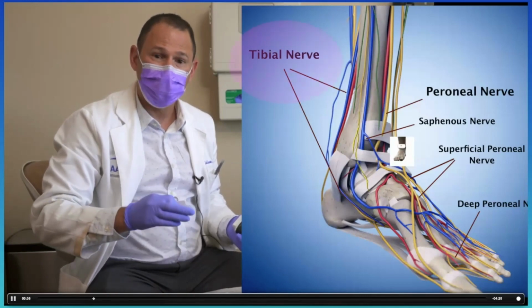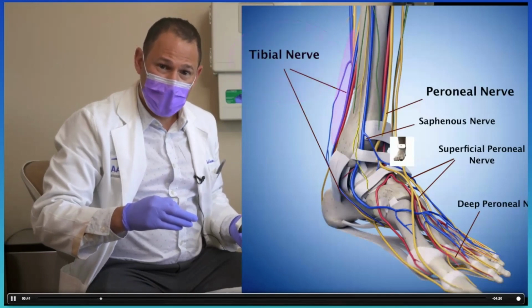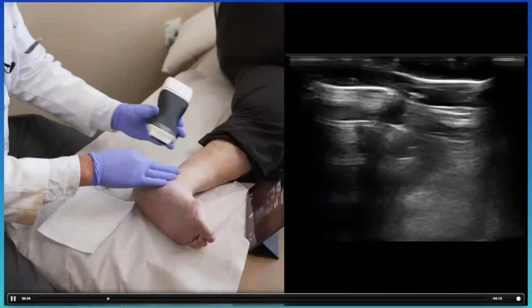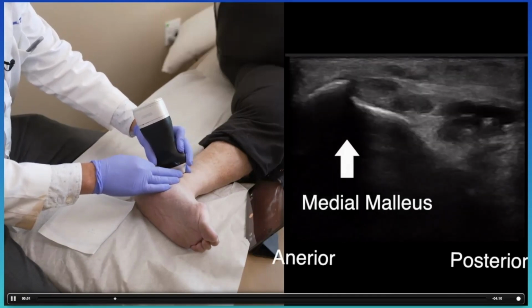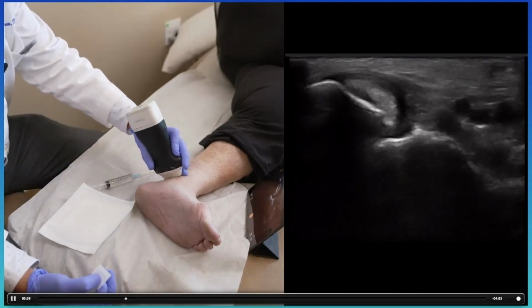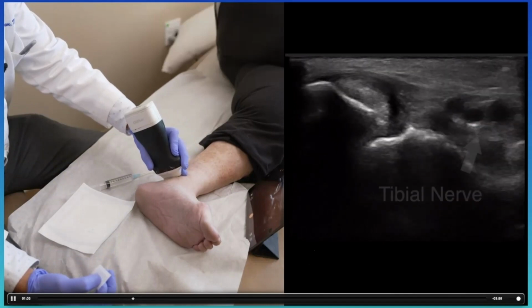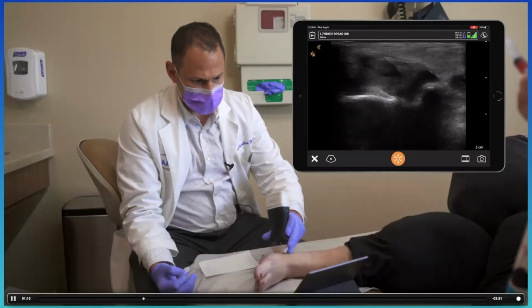So I'm going to go proximal to the tibial nerve, which innervates the medial and inferior aspect of the foot, and will hopefully give her enough anesthesia for the procedure. So to find the tibial nerve, I'm locating the medial malleolus. I visualize the nerve next to the artery. And one option is to go towards the tarsal tunnel, which is over here.